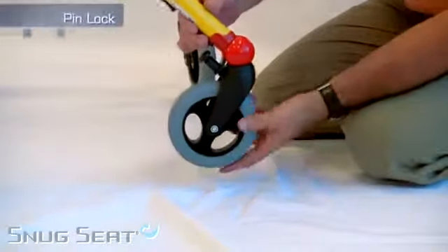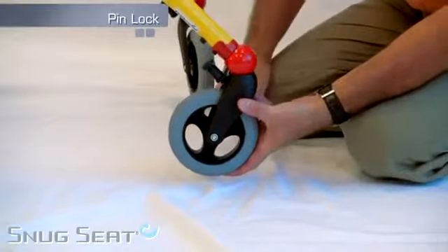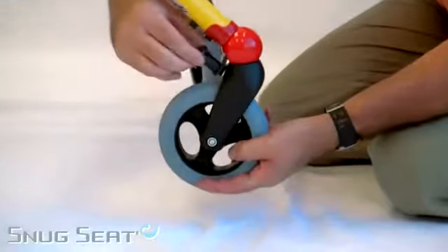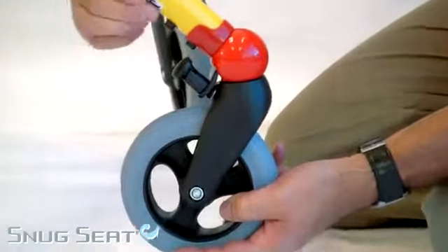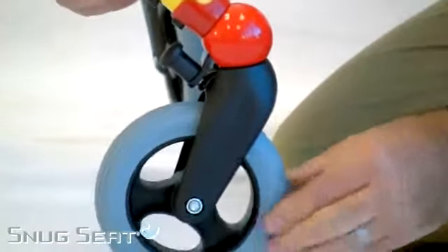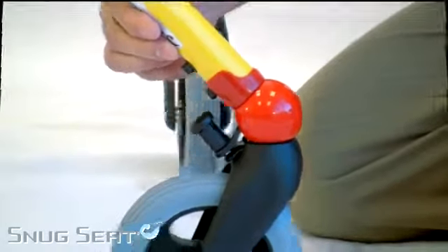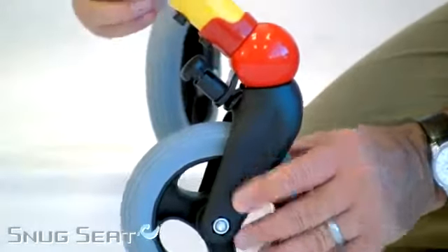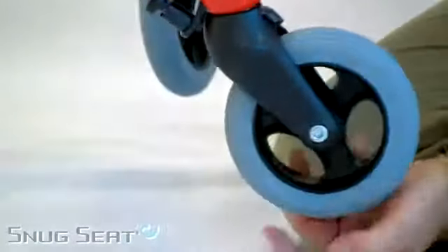The Crocodile also has a front caster pin lock. The casters spin 360 degrees, or you can simply turn the knob and lock it in place to have a unidirectional wheel. To remove, simply pull the pin, give it a half turn, and you are back to 360-degree swivel.